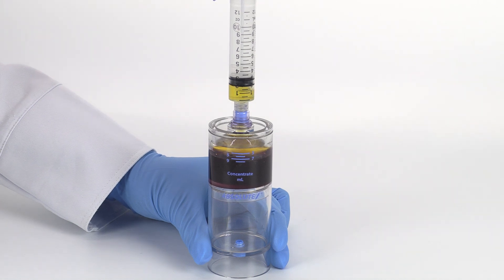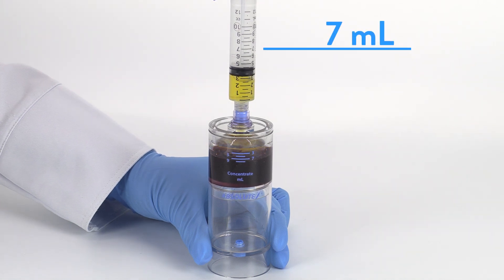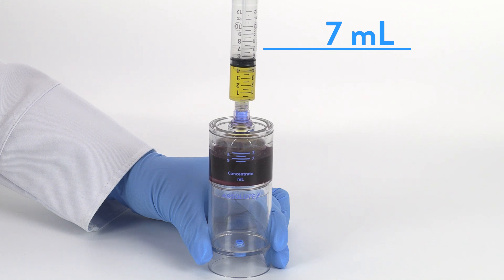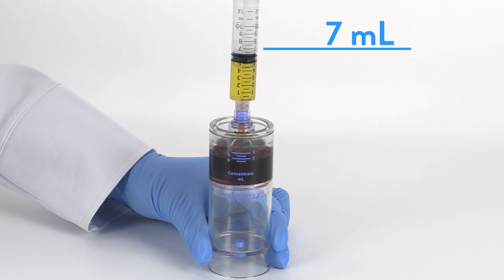Attach the 12 milliliter syringe to the needleless port and aspirate 7 milliliters or the desired amount of platelet-rich plasma.